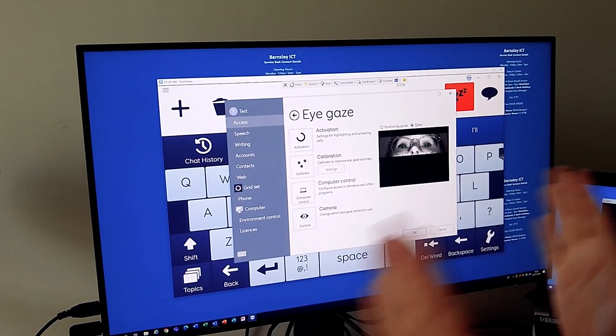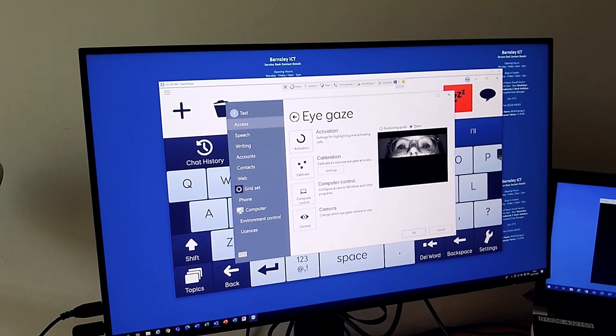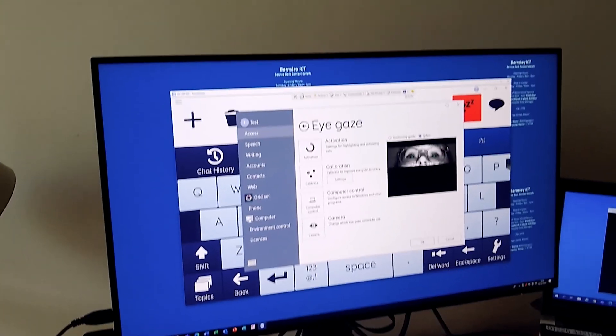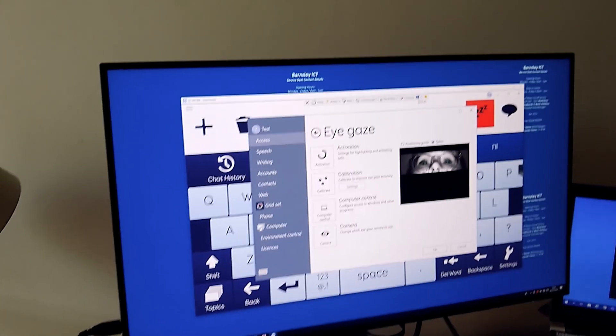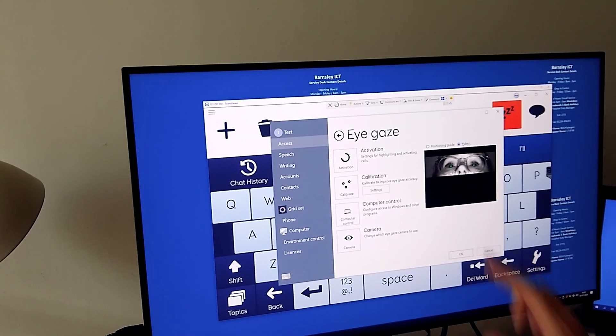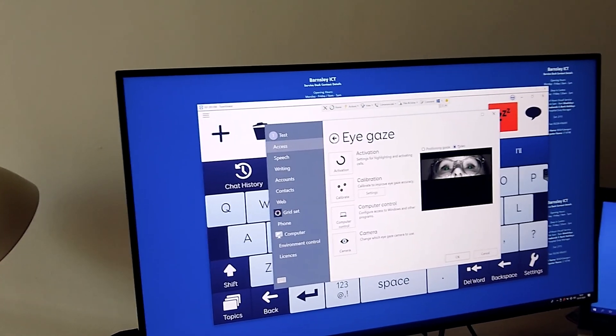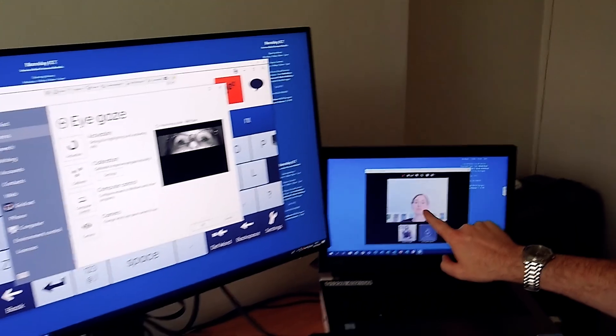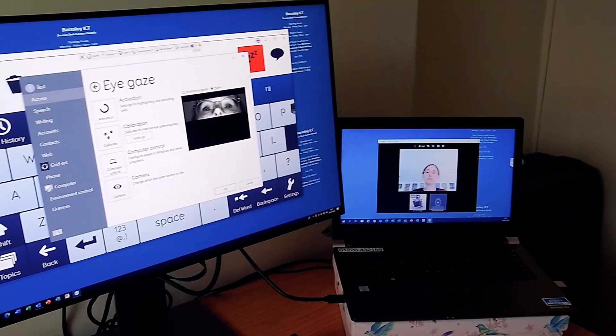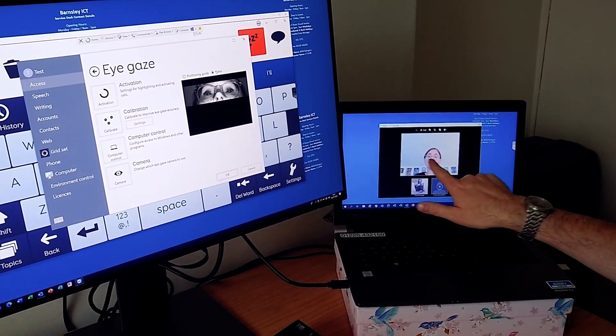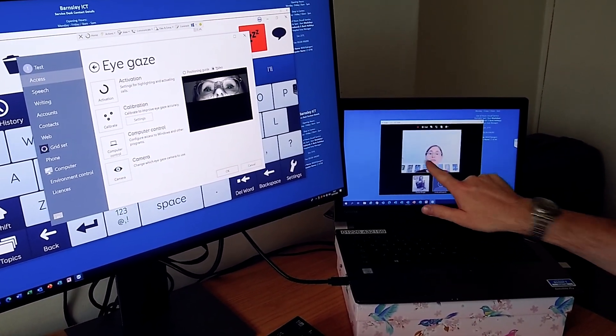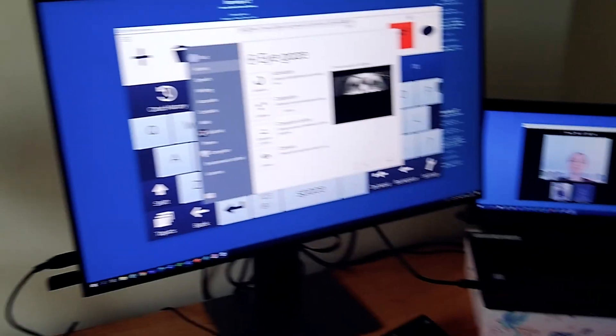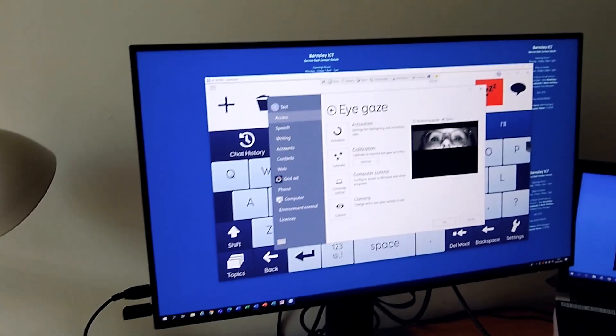I can check that they're not too dry and that she's got good movement in both eyes and that the pupils are the right size. If I didn't have this video system, that would be really difficult because if we look at the image over here with the webcam, it's quite difficult to clearly see what her eyes are like, so this is really useful.